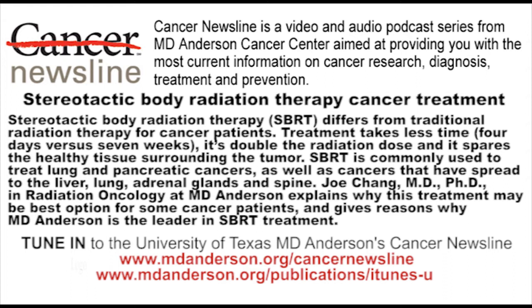Now, this is not really a new procedure, but there have been a lot of developments recently, has there not? Right, because recently we have what we call imaging-guided radiation therapy, and also four-dimensional CT imaging-guided treatment planning. We take the motion into consideration. We can deliver those more precisely to the target, for example, the lung cancer, and then we can afford to have a tight margin because of verification by CT on board.